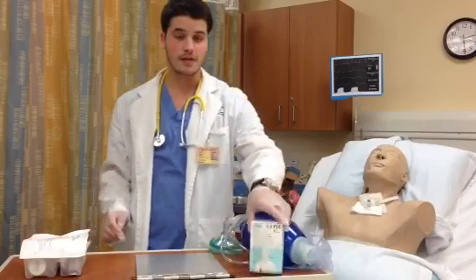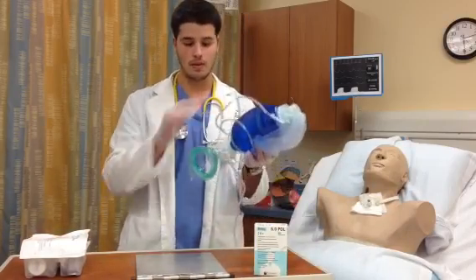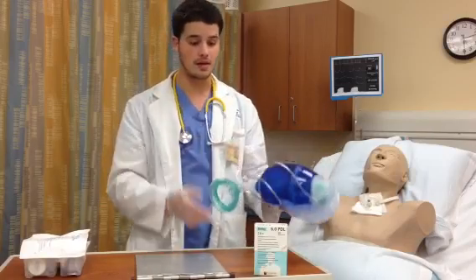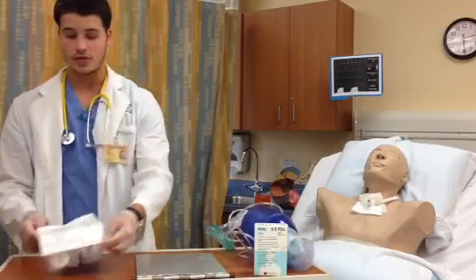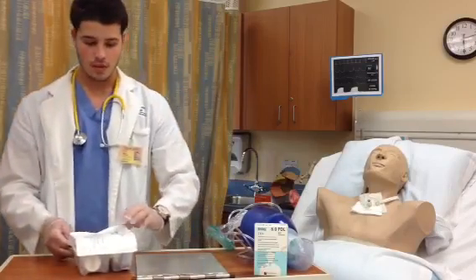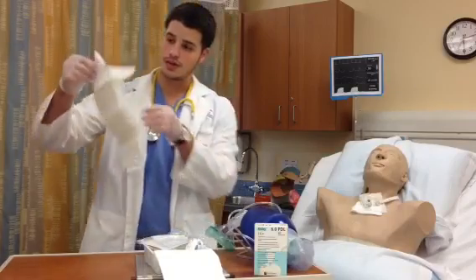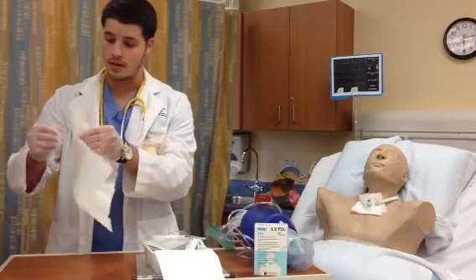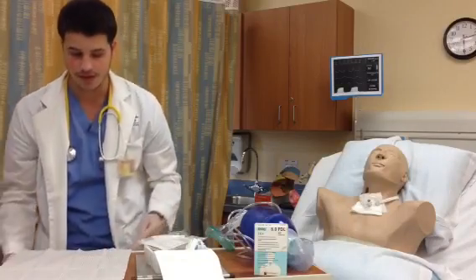My setup consists of an extra trach tube just in case, my BVM with a mask, because you can still ventilate a patient even though he has a trach, and my trach care kit. When you open it, you will have your sterile field. The part you touch is the part that's going to go on the bottom. You want to keep everything sterile.